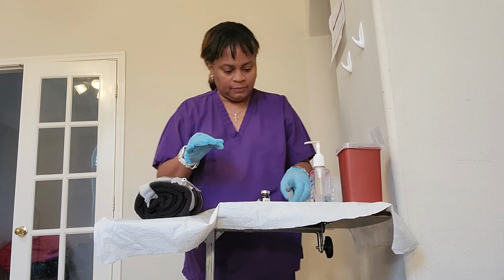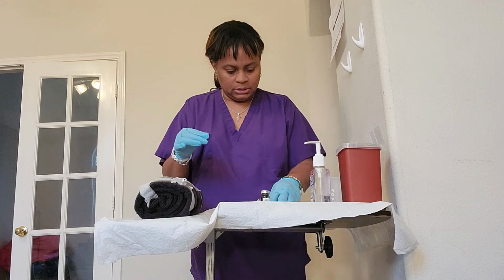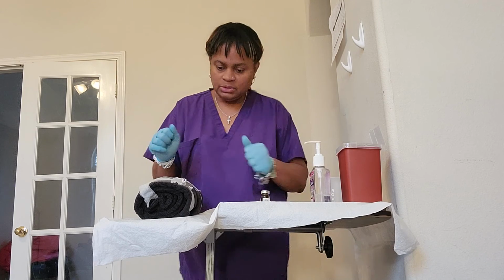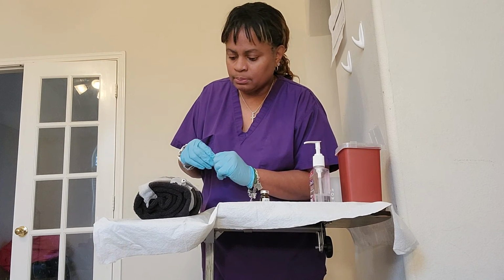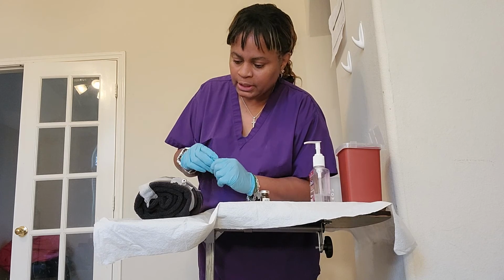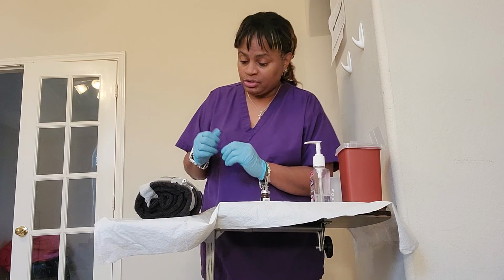Now we can dispose of the syringe in the trash because it is not a sharp. Now I want to assess your site here. Okay, so there's no redness, no swelling. Are you having any pain? No, good. There's no infiltration, no sign of infection, and it looks like everything looks good there. Okay, do you have any questions for me?